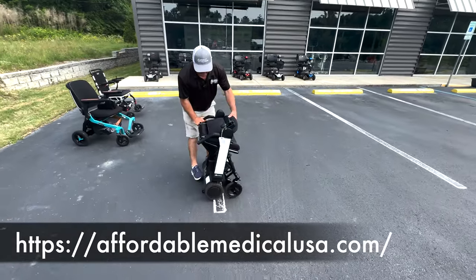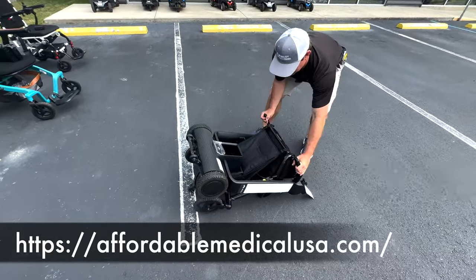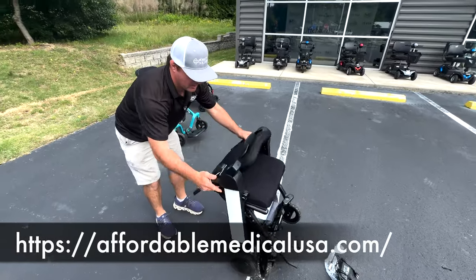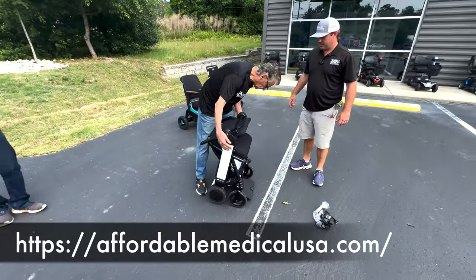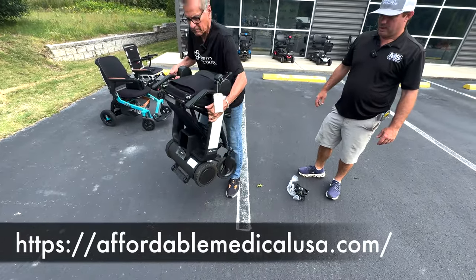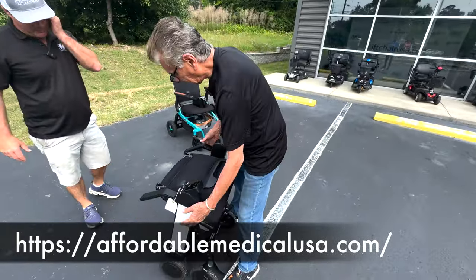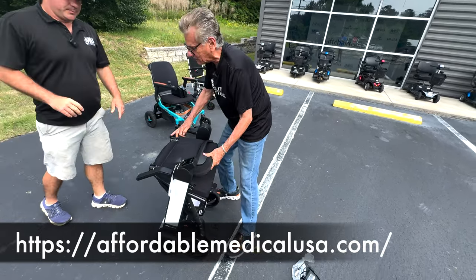You can put it into the car on its back if you want to, on its front, like so, on its back, like so. That's how you can travel with it, or you can keep it standing upright. Now, Eddie, try to pick this up. It's kind of an awkward way to pick up. That's about 55 pounds, I think. Kind of hard to find spots to pick it up at, wouldn't you say? Yeah, it's about 50 pounds. It's not that easy. But if you have somebody like you helping, it'd be different.